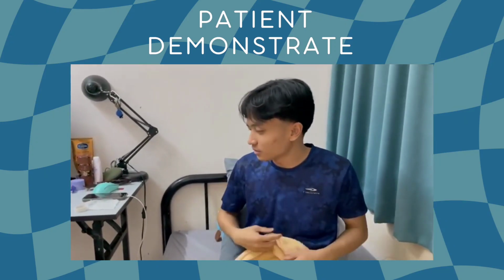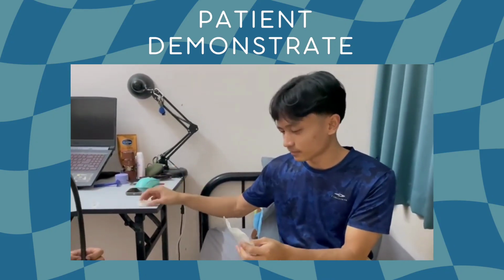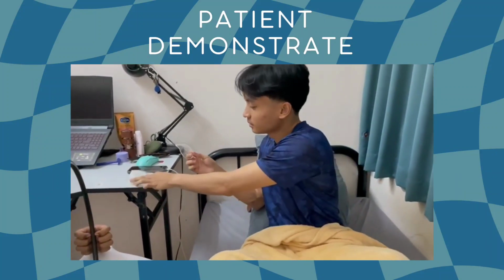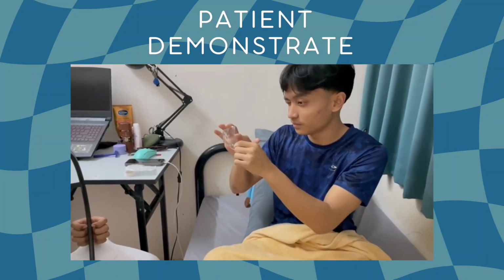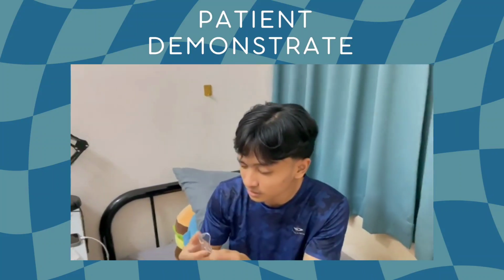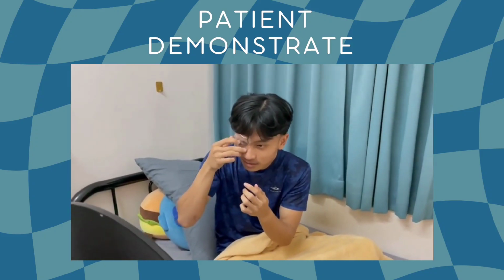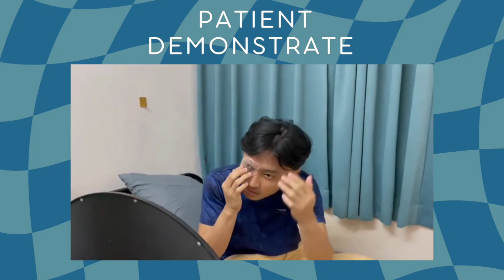So as told by you just now, there are two items that I need, right? Which is the eye shield and also the micropore. Yes. Okay. Since this has two parts, the round part and also the teeth, like you said just now. So is it like this? Yeah, like that. The tip will be going to your forehead, and then the round part will be on your cheek.